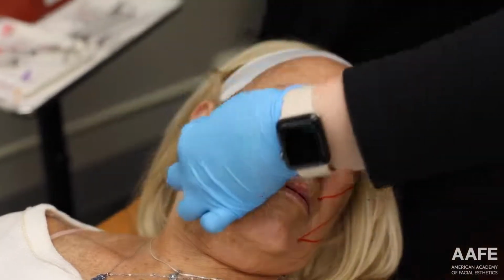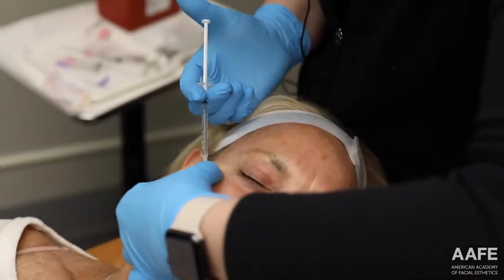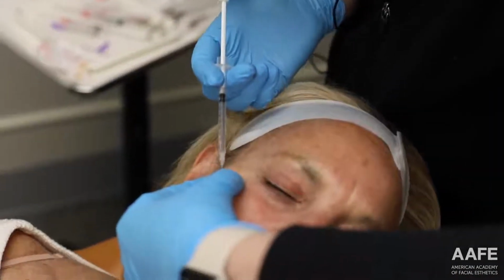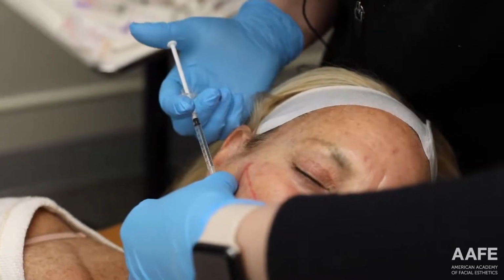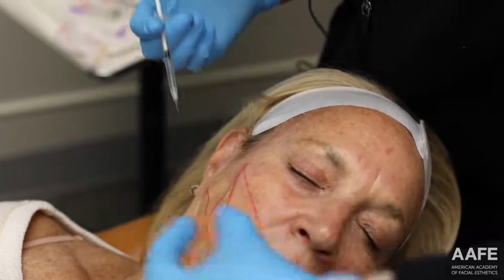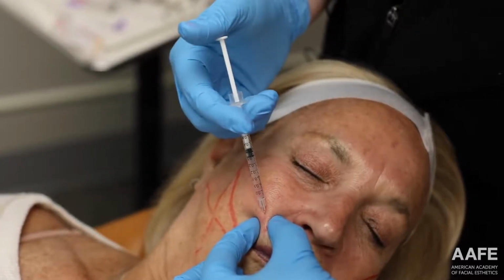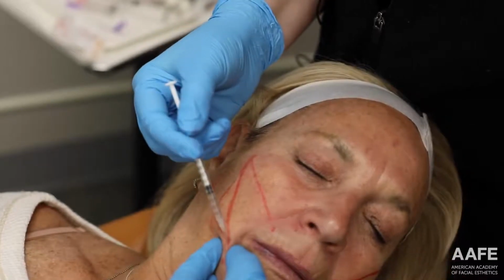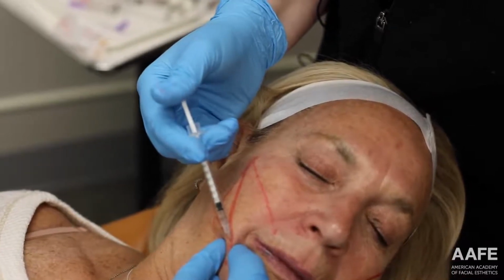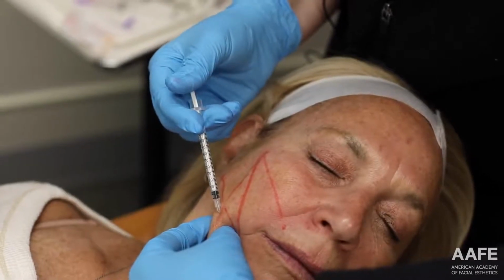All right, so I'm just gonna give you a little bleb of lidocaine, so a little pinch and burn. So this is 2% lidocaine. Little pinch and burn. And then I'm gonna give some down here as well. We just put it into our ComfortTox syringes, which is what we give our Botox with. It just makes it very easy for us to deliver little blebs. This is gonna keep her as comfortable as possible during the procedure.